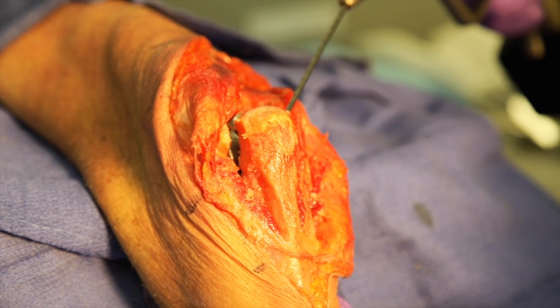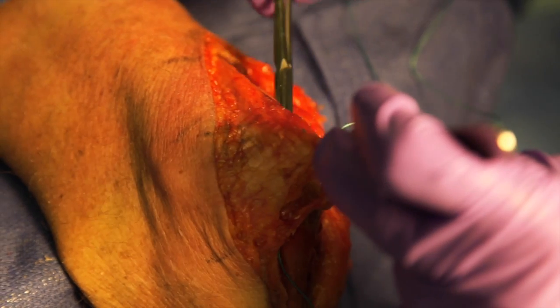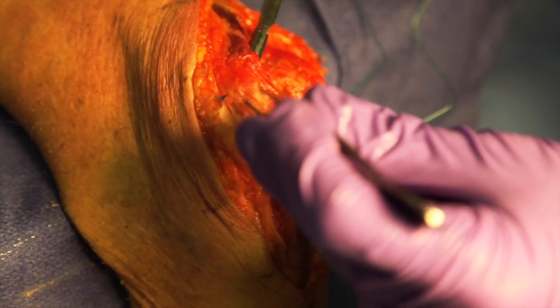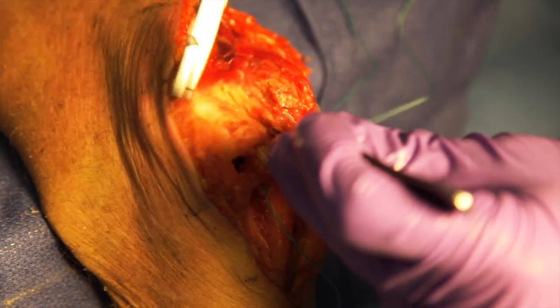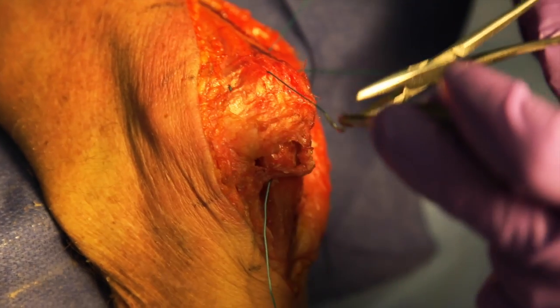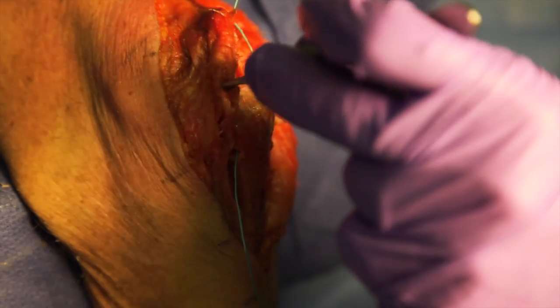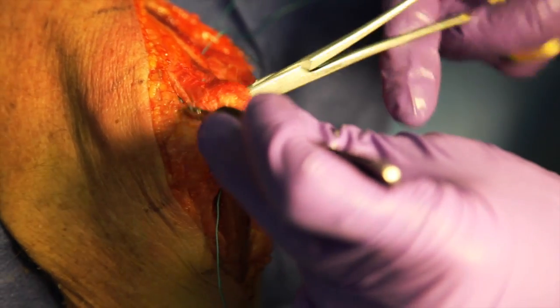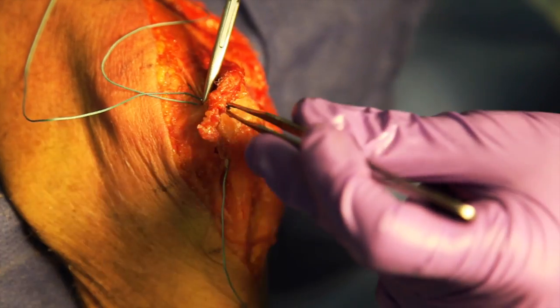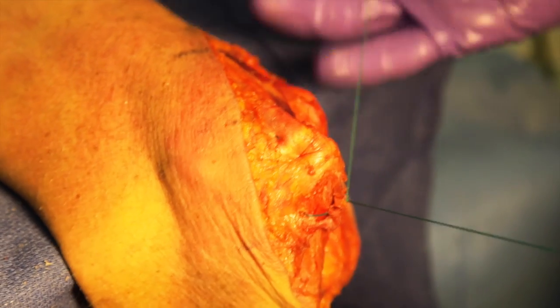The triceps tendon repair back to the olecranon is then performed. This is done with the use of two transosseous drill holes placed in a cruciate configuration. The first drill hole is drilled from the medial aspect to the lateral aspect of the olecranon, and a Keith needle is used to pass the suture. The suture is then passed through the tendinous portion of the triceps in a cruciate formation. The second tunnel is drilled and a Keith needle is used to pass the suture. The suture is then tied over the olecranon.